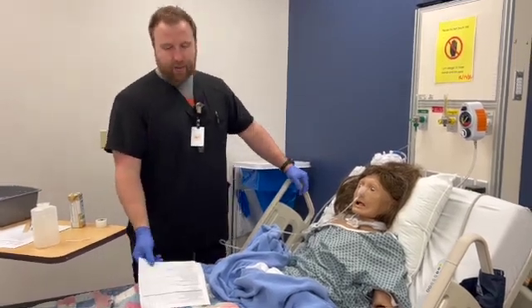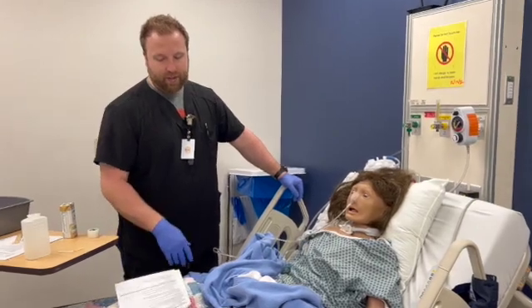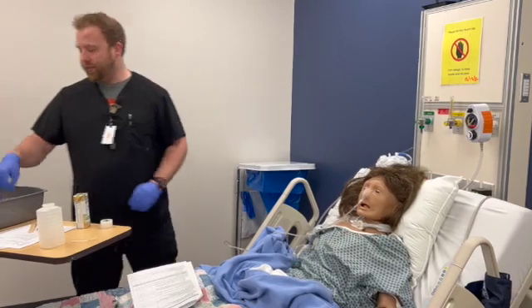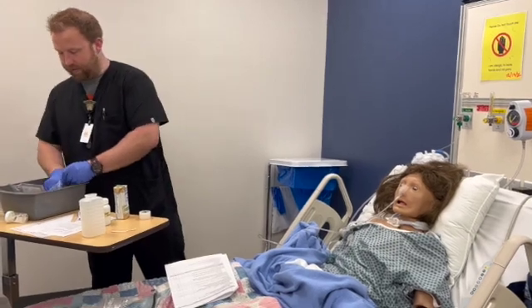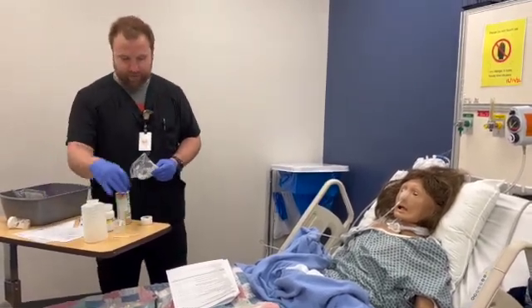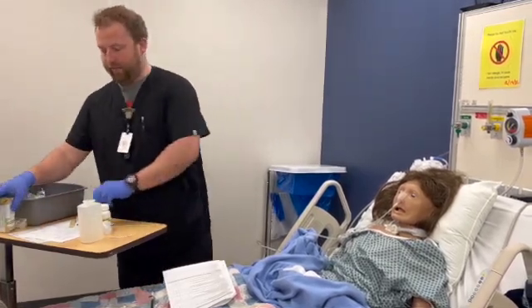Now we'll document Stan's intake and how well he tolerated his tube feeding. Our third one is going to be our medication administration. You'll have 2 meds due next week. We'll have prednisone, and we will have metformin, but we're just going to do prednisone.